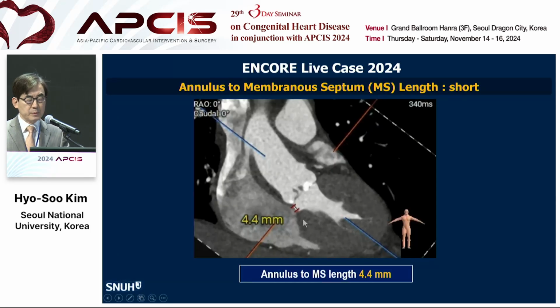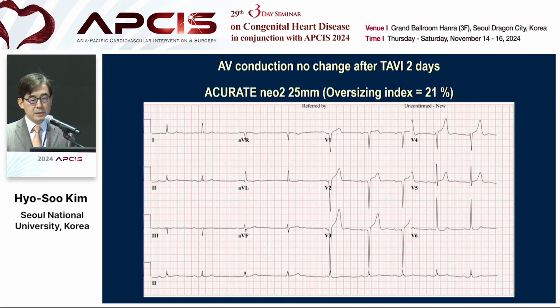and the membranous septum is very short. Thus, we have some concern about AV conduction block after TAVI, but AcurateNeo is a very soft TAVI valve, top-down, with minimal damage to the LVOT, no conduction block.